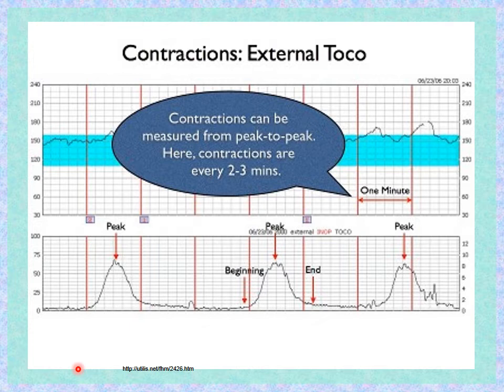Relaxation time is commonly 60 seconds or more in the first stage of labor and 45 seconds or more in the second stage. Relaxation time is the time that the uterus is resting. Montevideo units are a unit of measure used with an internal fetal monitor. They usually range from 100 to 250 in the first stage, rise to 300 to 400 in the second stage.